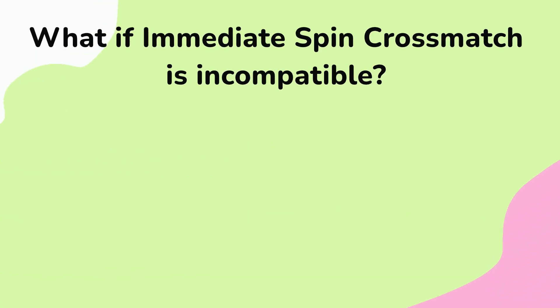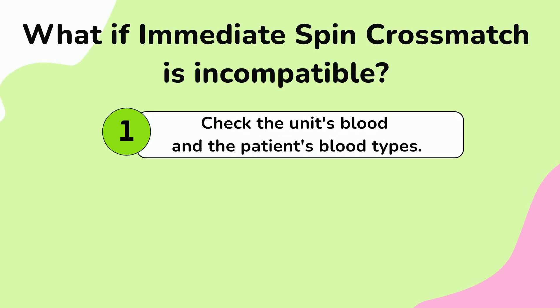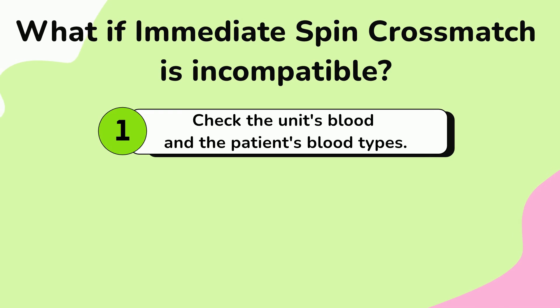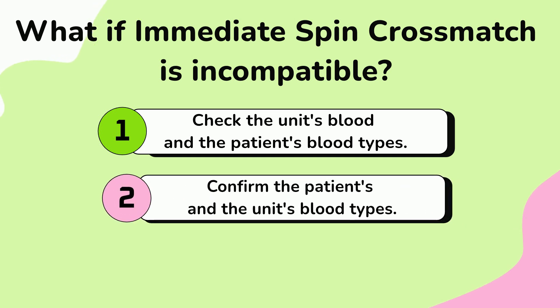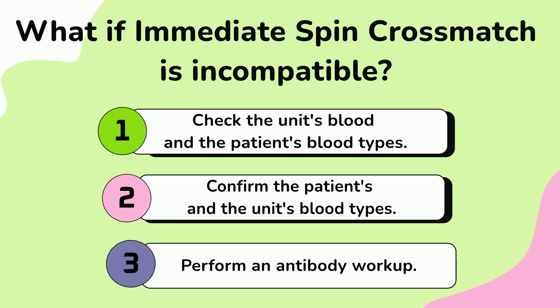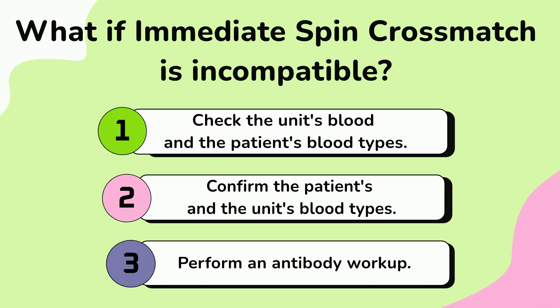What do I do if my crossmatch is incompatible on immediate spin? You will check the unit type and the patient type, making sure you are crossmatching the right patient and that the unit's blood type is compatible with the patient. If you got the wrong unit from the shelf, put it back, get the correct unit, and repeat the test. If the unit is correct, retype the patient sample you are using for the crossmatch. After confirming that the blood types for both donor and patient are correct, you may have to perform an antibody workup to further investigate, making sure that antibody is not the root cause of the incompatibility. Some reasons that an immediate spin would be incompatible are ABO incompatibility, cold antibodies, or rouleaux.